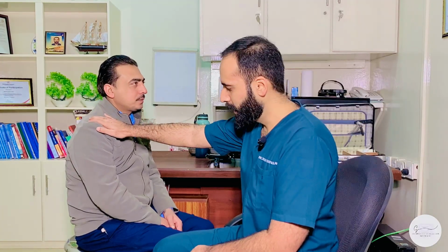Then comes your position. In ENT, you should always be either on the right side of the patient or on the left side of the patient. And you need to be at the eye level of the patient. So right now, I think that I am slightly higher. So I'm going to adjust my seat so that I am in line with the patient. I should be 1 arm length away and I am sitting on the right side of the patient.